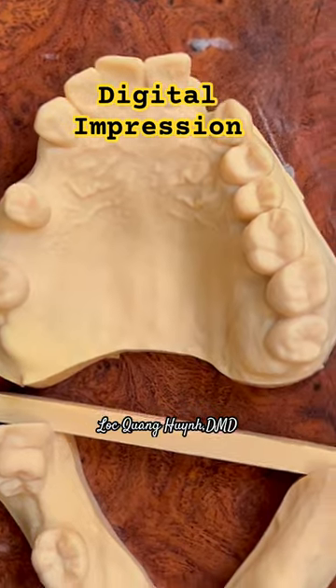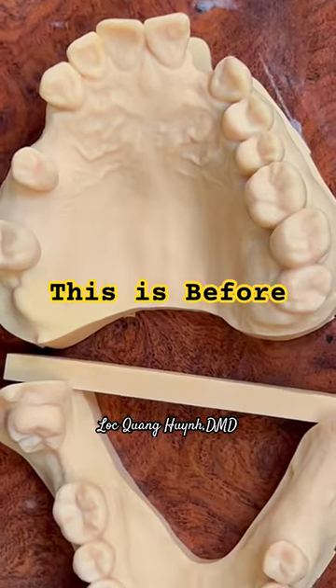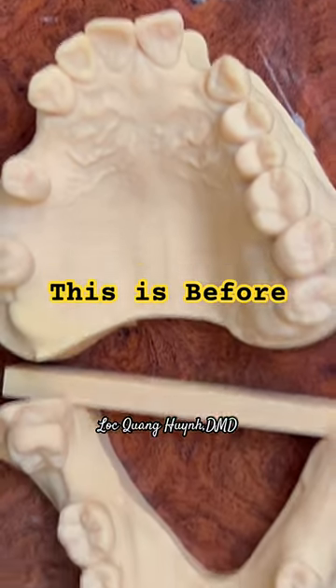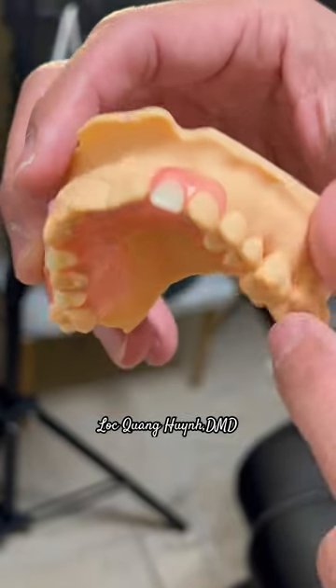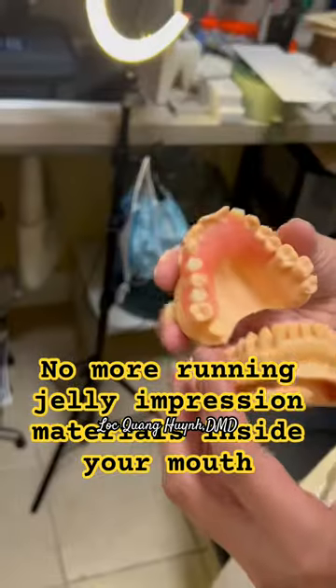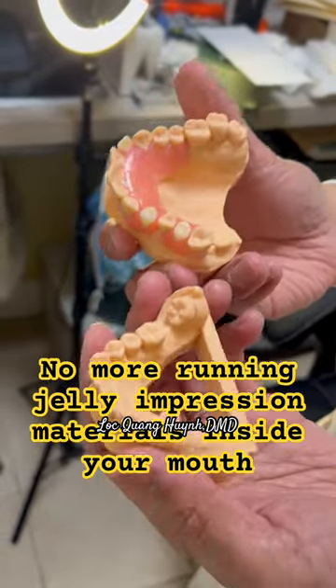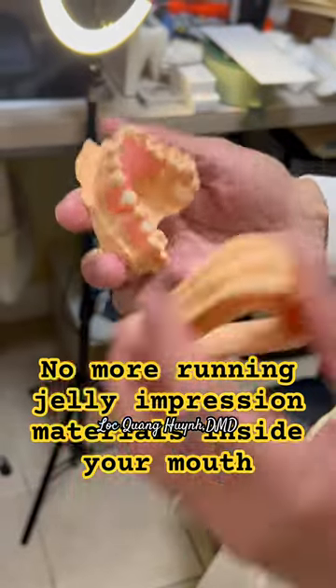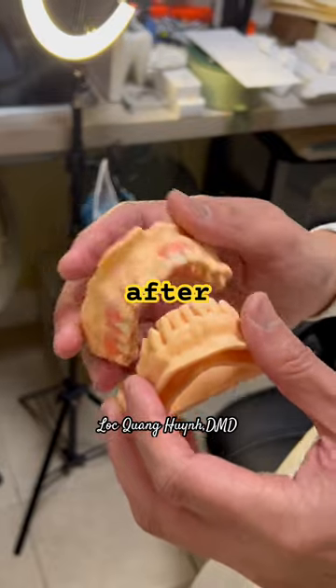I'm going to show you this case. The lab design is very nice. The reason I show you this case is for the purpose of a couple things — we're using a digital lab, everything digital. They print this out as a 3D model and they also do the denture.